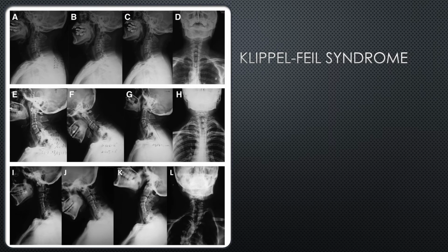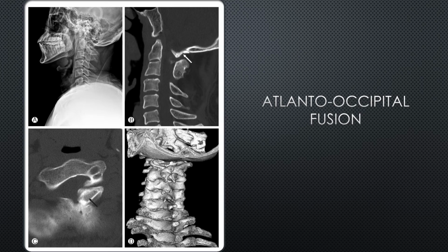So these can very easily be seen on radiograph, but obviously CT can help further characterize these abnormalities, such as in this case of occipital fusion, where you get a suggestion on radiographs, but it's really much easier to depict on CT with these 3D reformations as well.